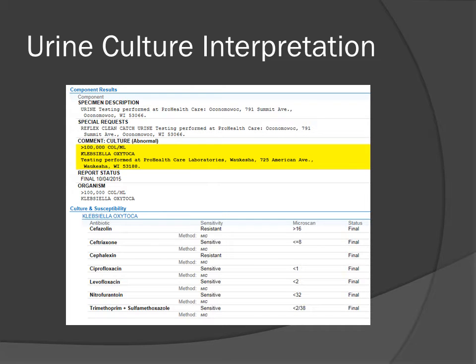In this situation, we've got a urinary culture that is positive for one organism, and it's a Klebsiella species, which is a gram-negative rod, and greater than 100,000 colony-forming units per milliliter. This looks like a robust, positive urinary culture. You'll notice that afterwards it has the sensitivity data. So if we take a look, it's got the sensitivity data and the minimum inhibitory concentration for each bug.